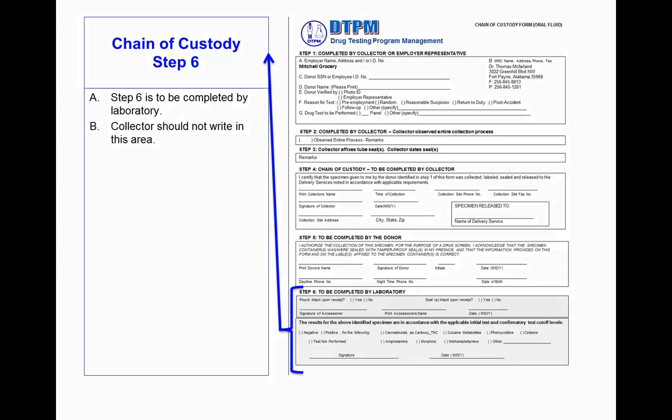Okay, Step 6. Step 6 is to be completed by the laboratory. It's not something for you to worry about. It's only to be done by the lab.